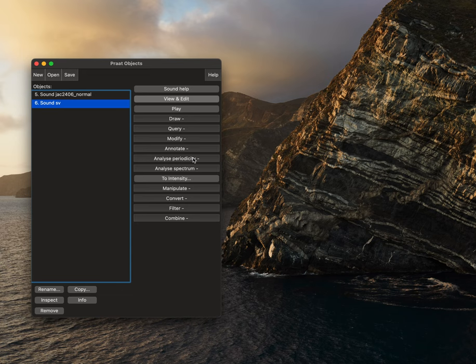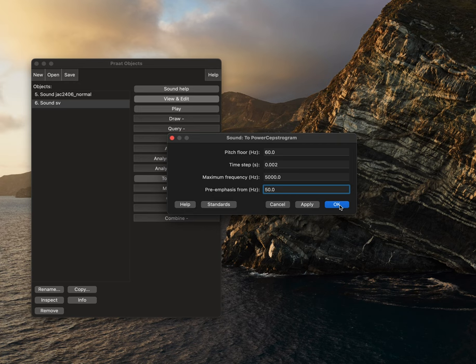We'll then select analyze periodicity to power cepstagram. Our settings should be this, and this should be the default, and that will be okay. So then we'll select okay.